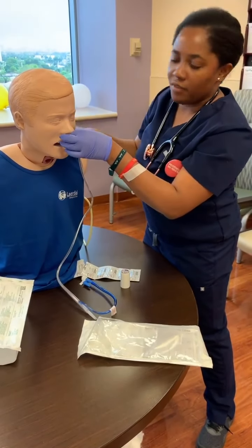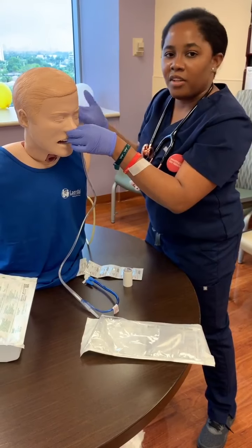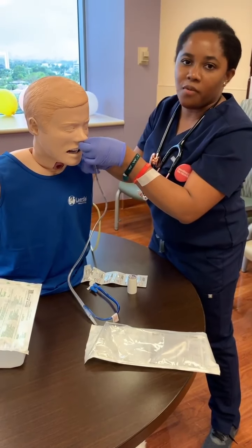We're also checking to see if the patient is uncomfortable. They may feel a little discomfort because this is not comfortable, but you want to make sure the tube doesn't land in the lungs because that would be really bad.